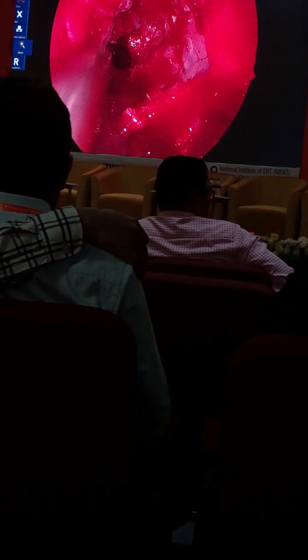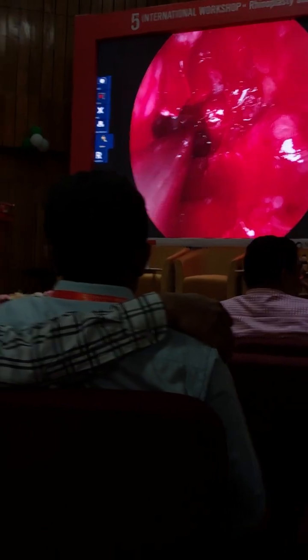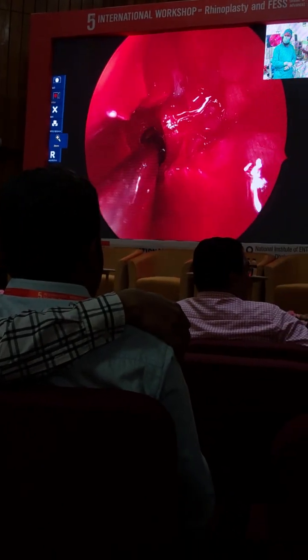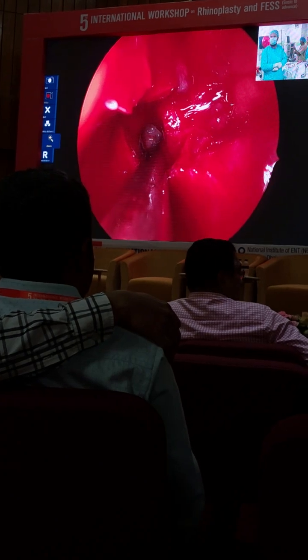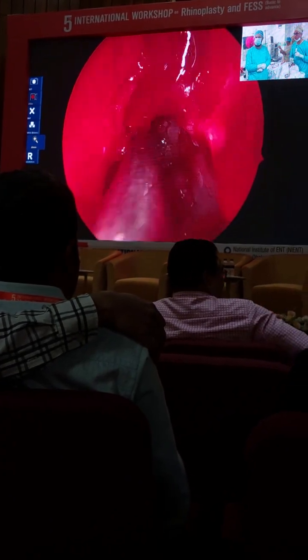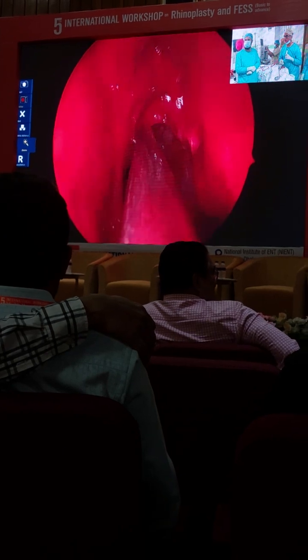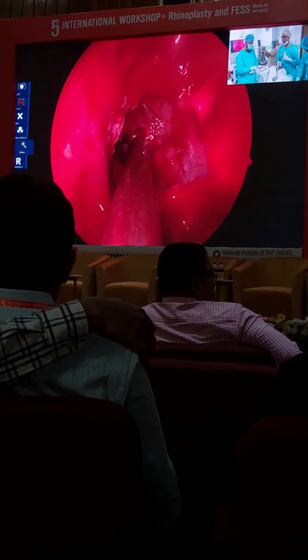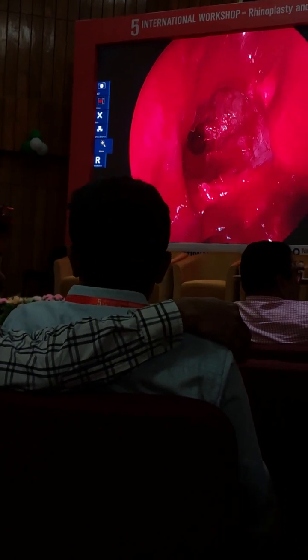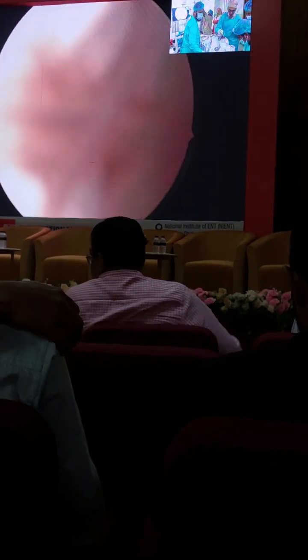I don't think the patient head goes up anymore. Okay, but now you have a good view inside the sphenoid. What you see right in front of you is the sella. Okay? And we try and show you optic and carotid later. First, let's concentrate on what we have to do. Give me a ring. My instruments. Is there a ring here? Give me that.